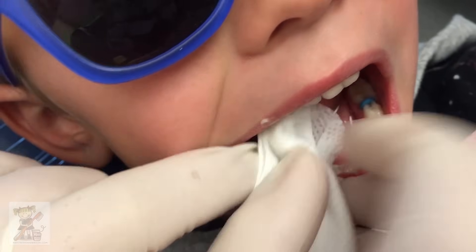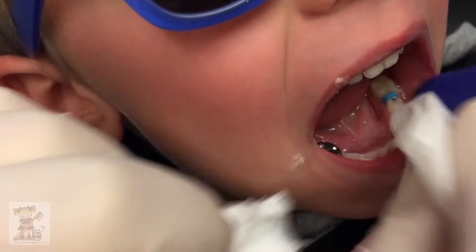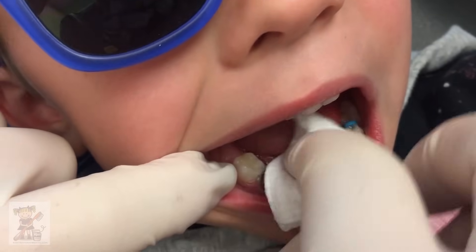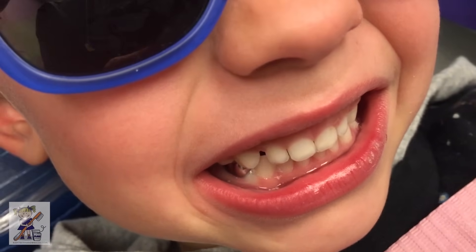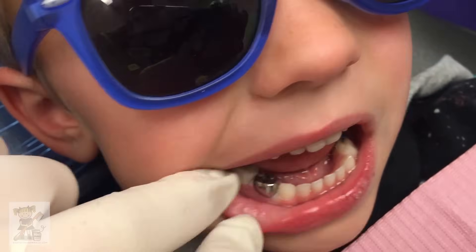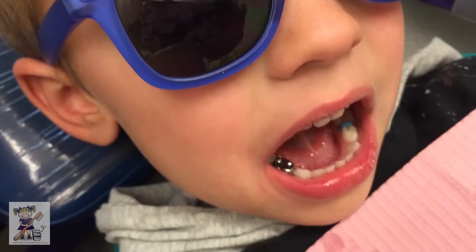So firm pressure — it might be a little uncomfortable from the tightness, I'm sorry, lovey. Can you help me? Can you bite on my cotton? Bite real tight. And then we're going to wipe away that glue. Are you okay? You're so sweet. You did it. Bite your teeth together like you're Spider-Man!